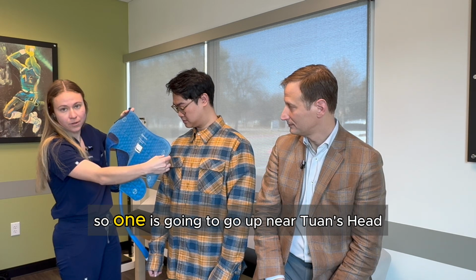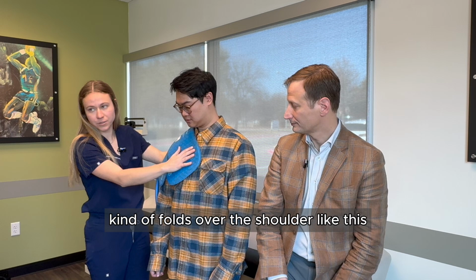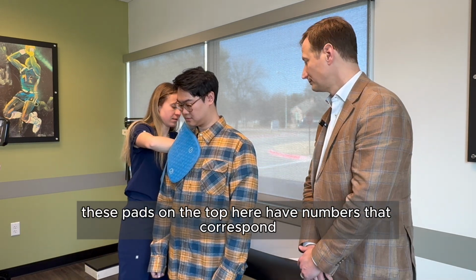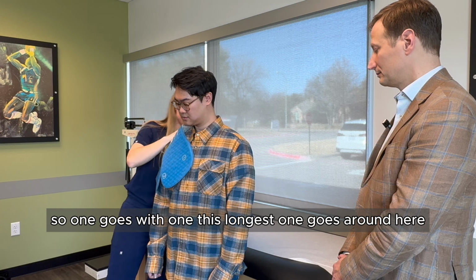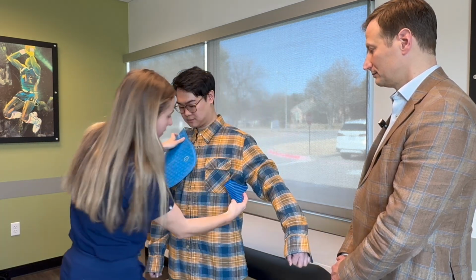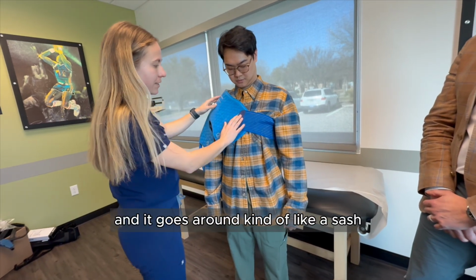So 1 is going to go up near Tuan's head as much as possible, kind of folds over the shoulder like this. These pads on the top here have numbers that correspond. So 1 goes with 1. This longest one goes around here. Kind of have to go across the person. And it goes around kind of like a sash.